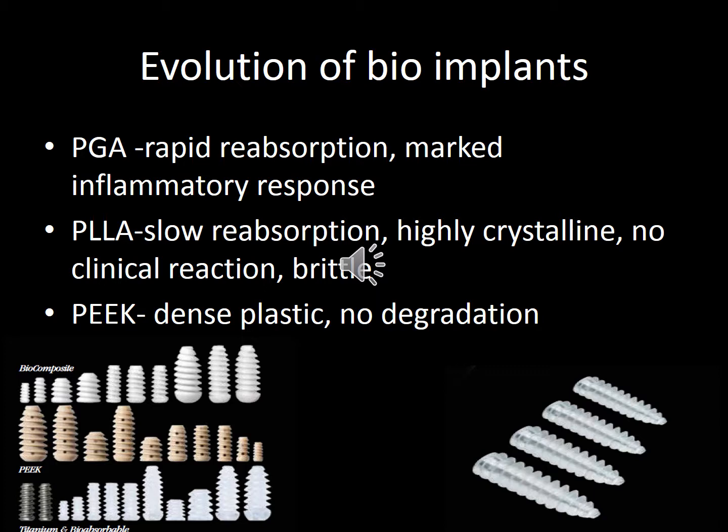PLLA, poly-L-lactic acid. It has good strength and a long degradation period, 2 to 5 years. It has very good strength of fixation. It slowly reabsorbs and it has complications like tunnel enlargement, osteolysis and cyst formation.